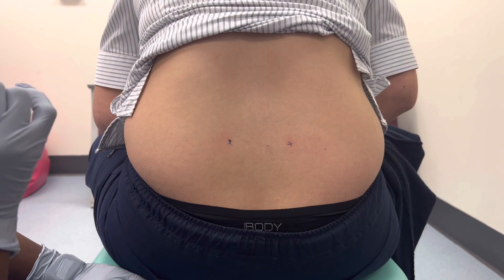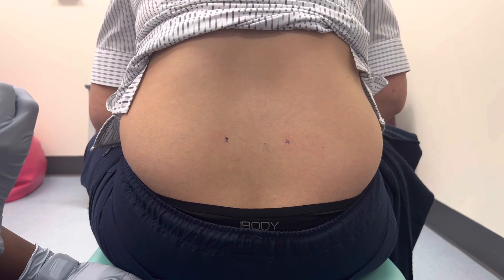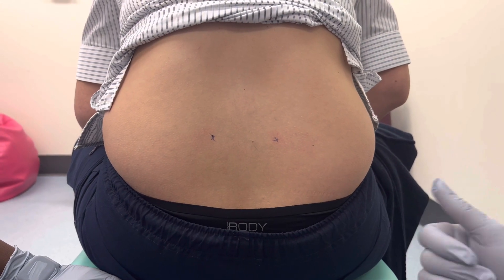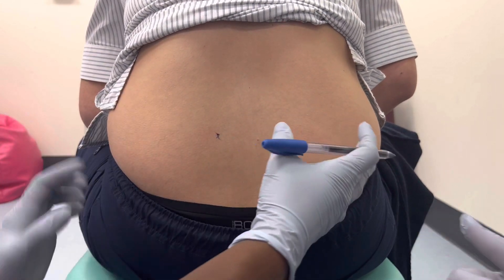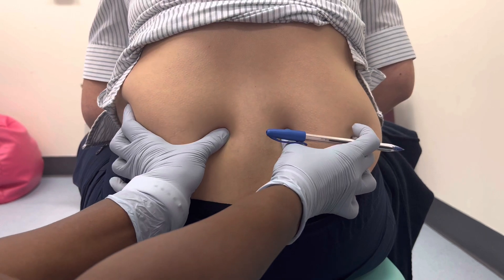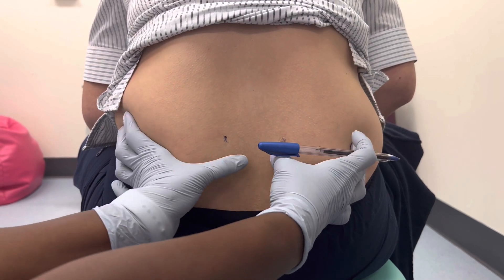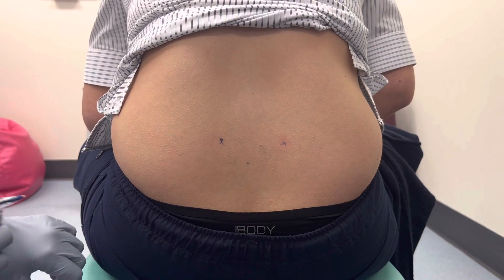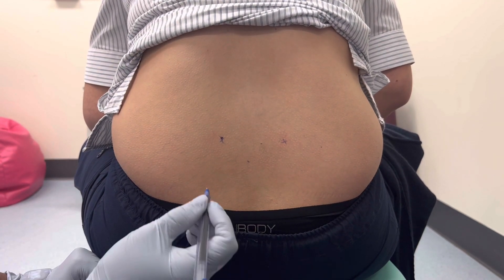It's always best practice to check with a second accredited person — either a midwife or a doctor — to confirm the sacral dimples again, so they can also feel the location. Once confirmed, we're happy to proceed with the injections.